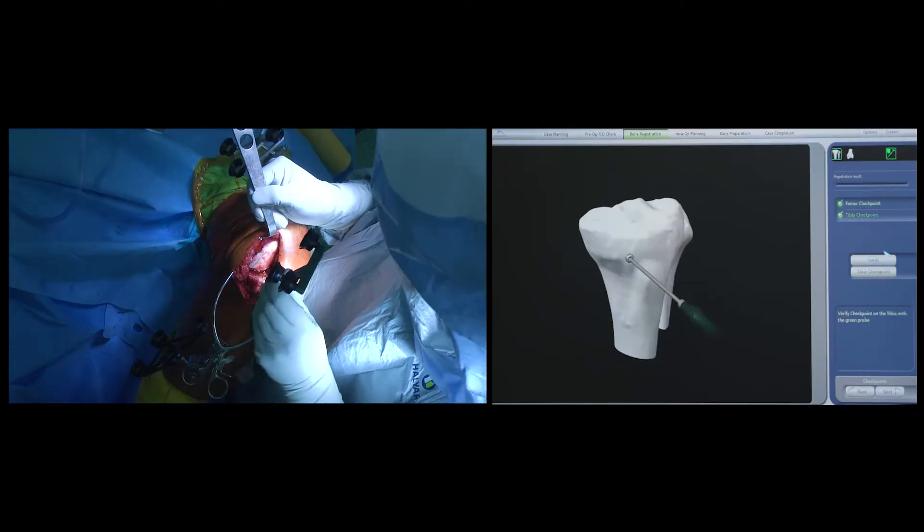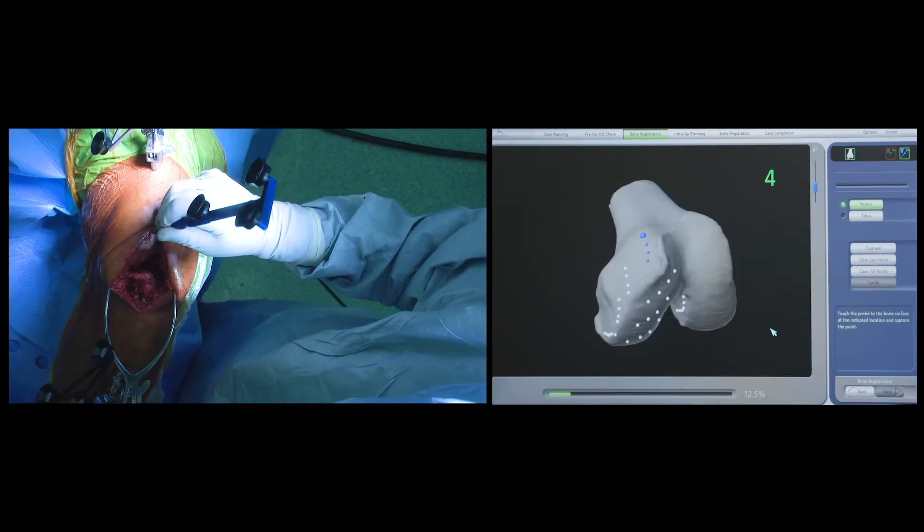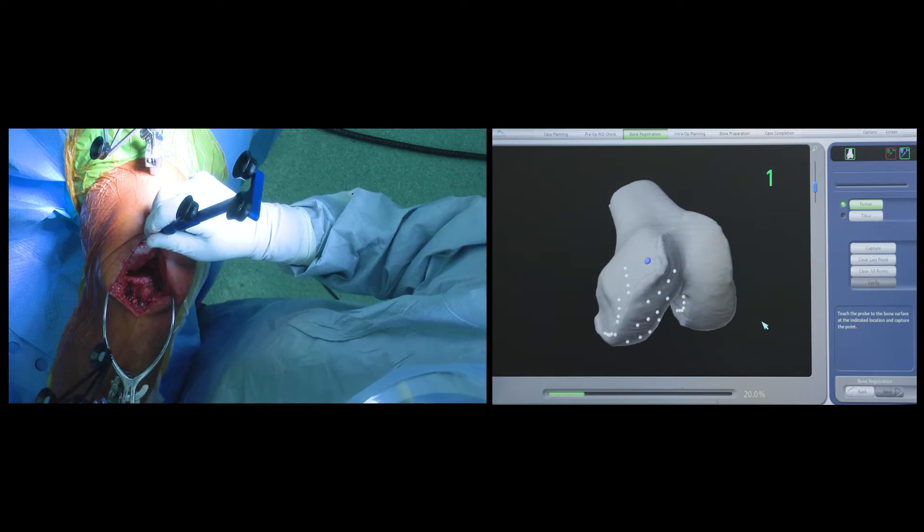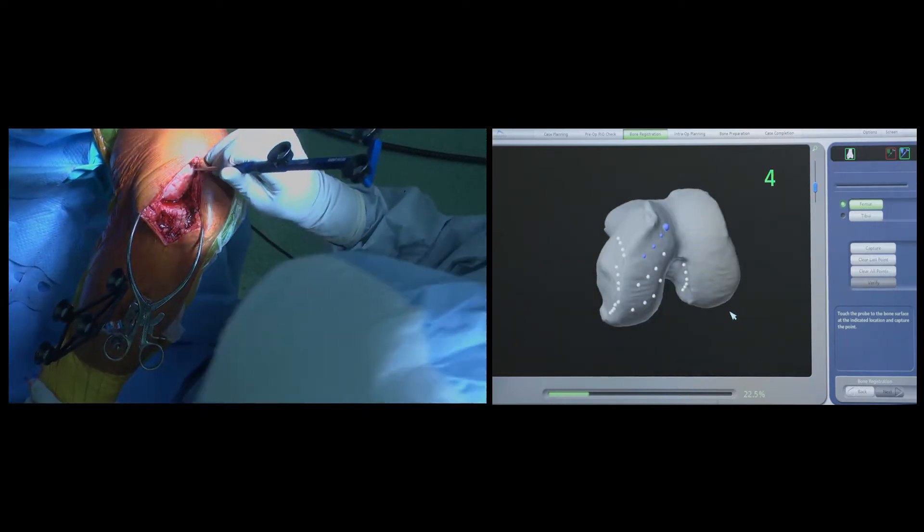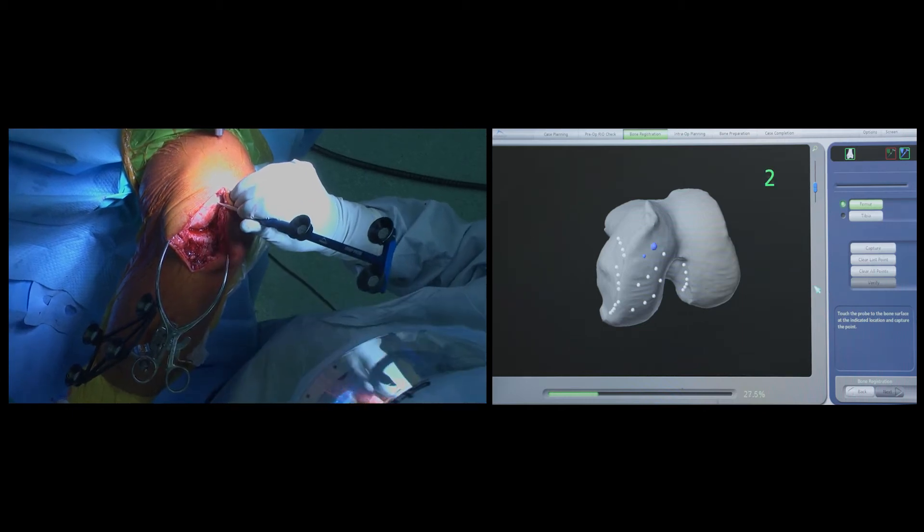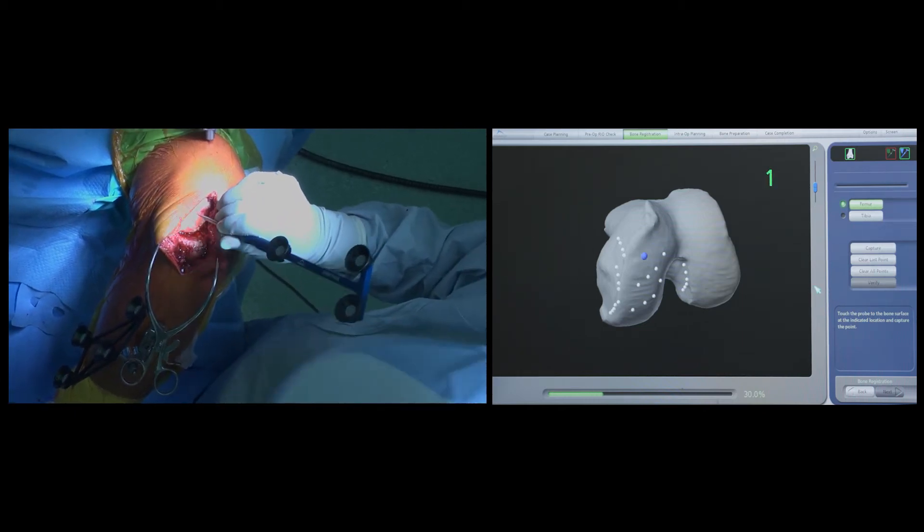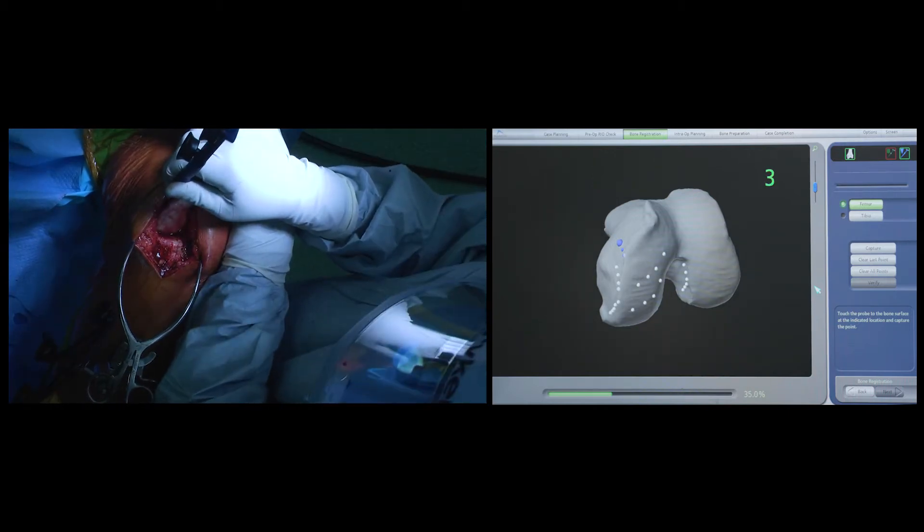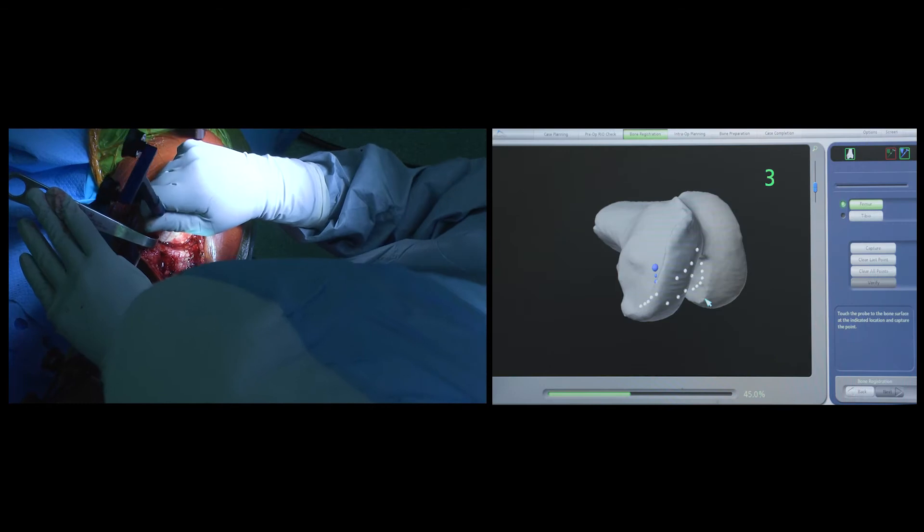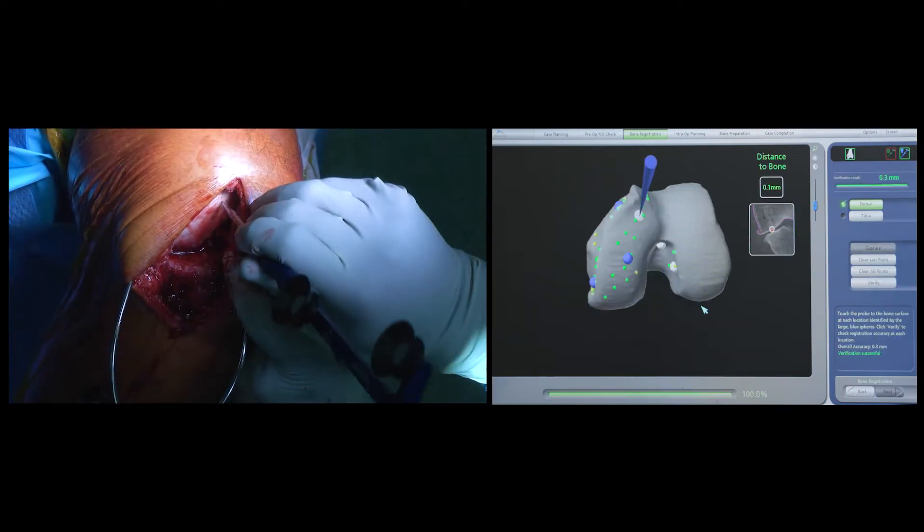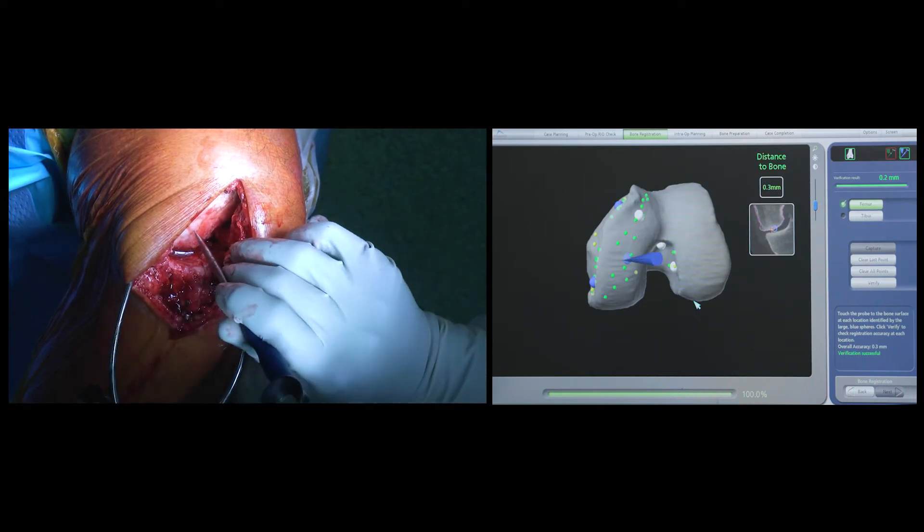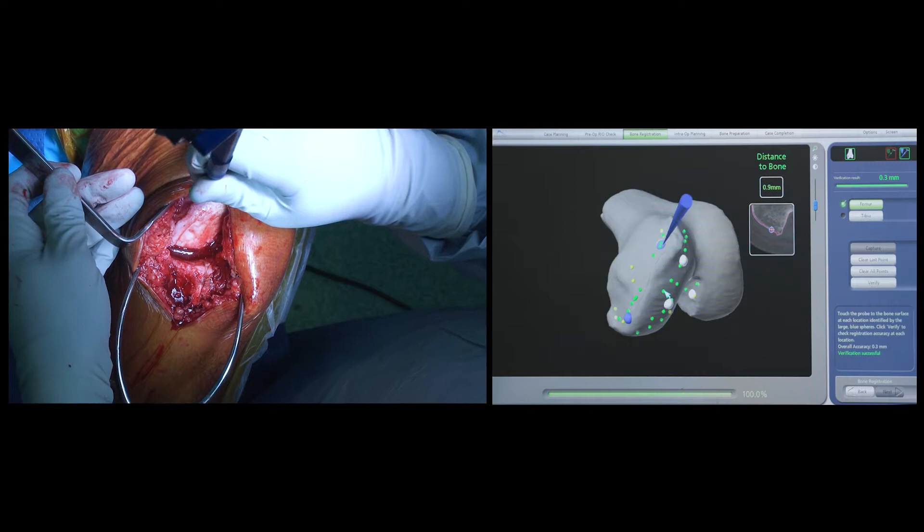The next crucial step is to match the 3D computer-generated image of the patient's knee to the patient's actual anatomy. This is done by registering anatomic landmarks as shown on the screen and matching them on the patient's knee as closely as possible. A number of landmarks are taken throughout both the surfaces of the femur and tibia, spread out over a large surface area to get a very tight and accurate match between the two.